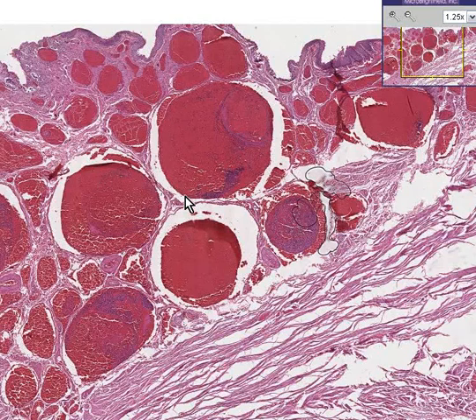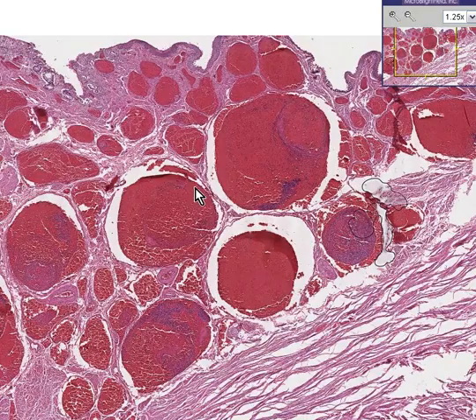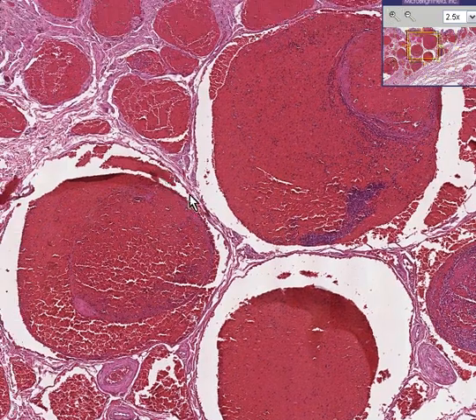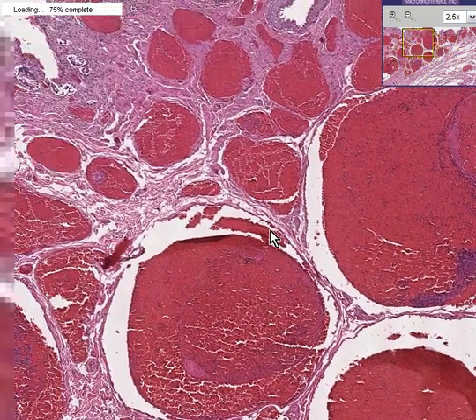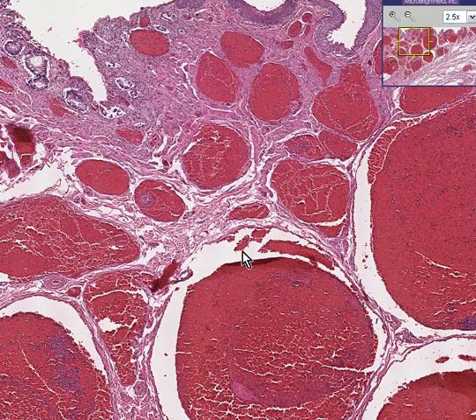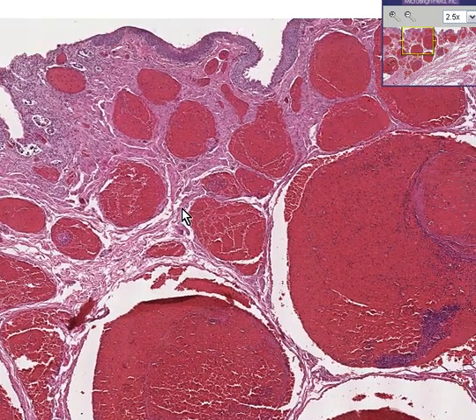Here are large dilated vascular spaces lined by thin amounts of smooth muscle, which means they are veins. They are dilated congested veins.